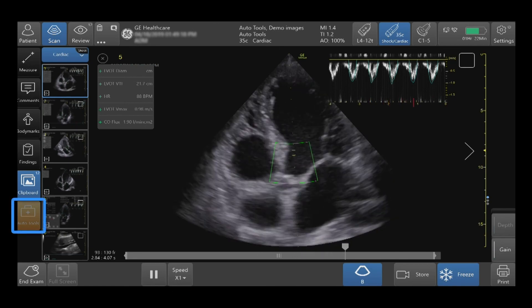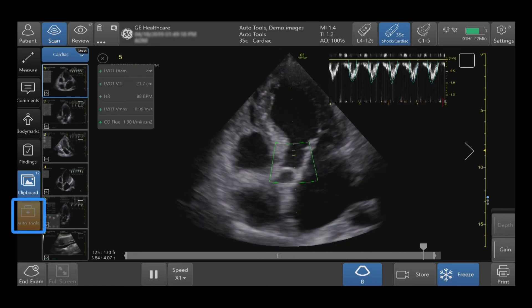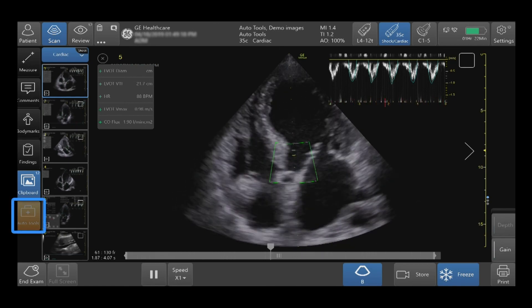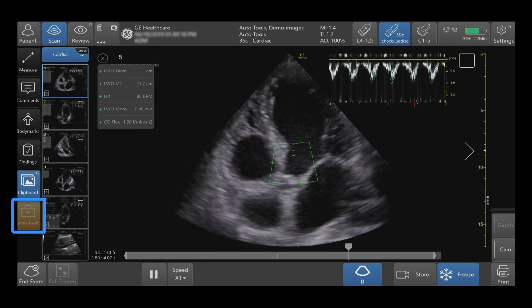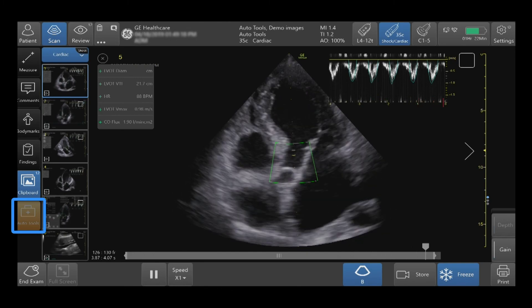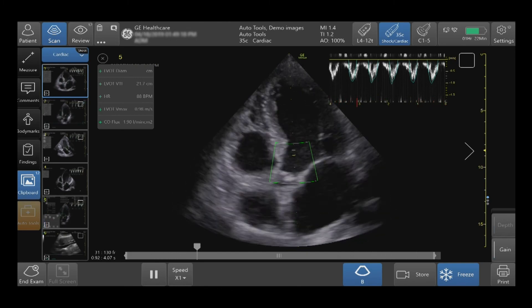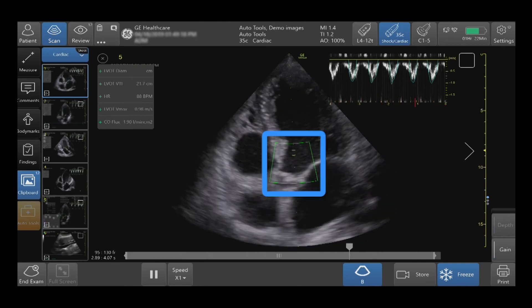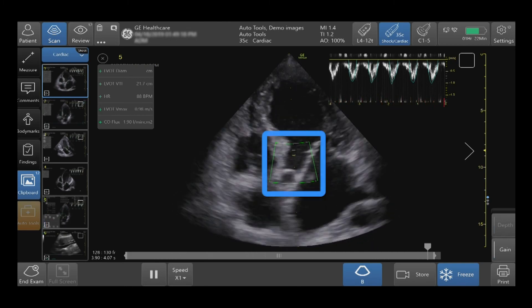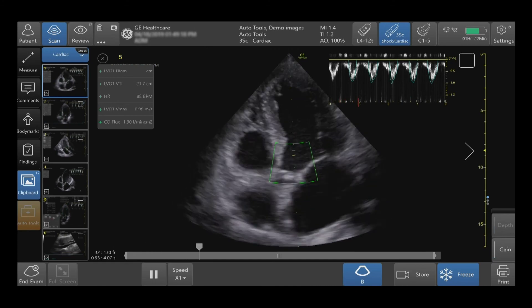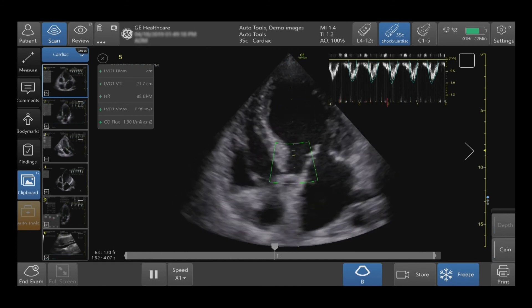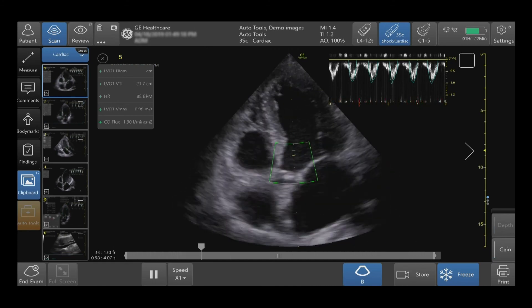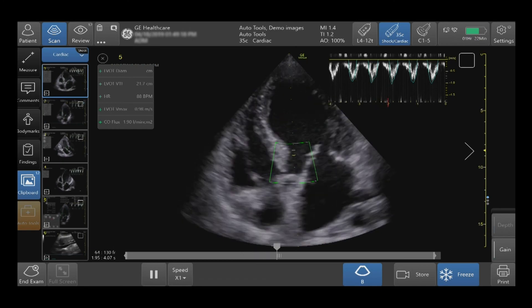Select the AutoVTI Tool if you are scanning live, located in the bottom left hand side of the touch screen. Your quality indicator will now be displayed. When green, the results are highly likely to match calculations created by an expert.